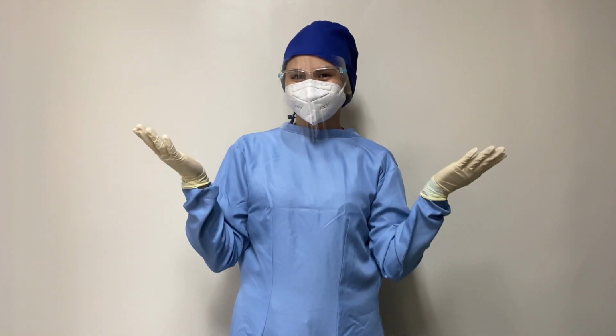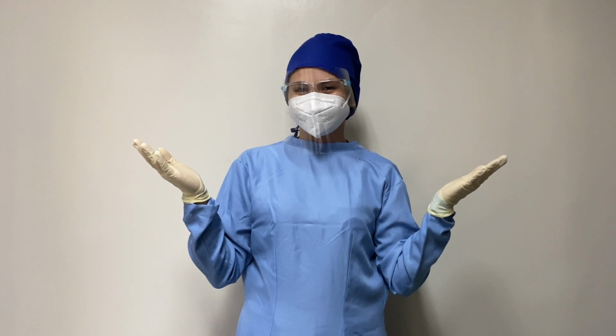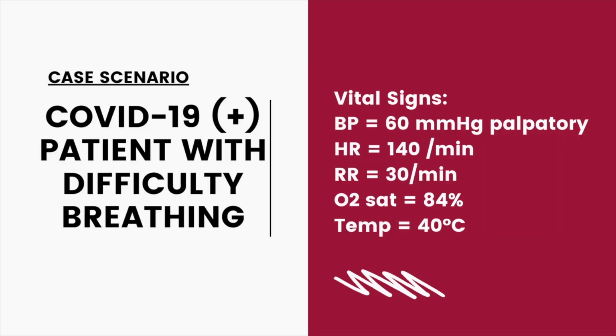Good day everyone, this is Senior Clerk Goldemir Israel, and in this video, I will be showing you how to perform an endotracheal intubation. We have a case of a COVID-19 positive patient to be intubated after the patient had difficulty in breathing, with the following vital signs.